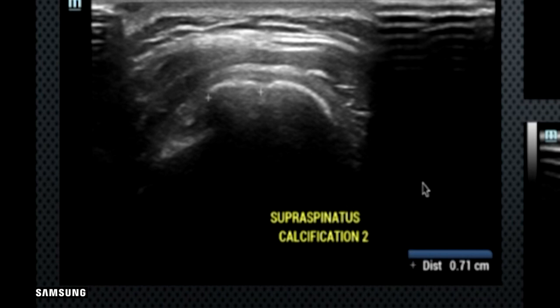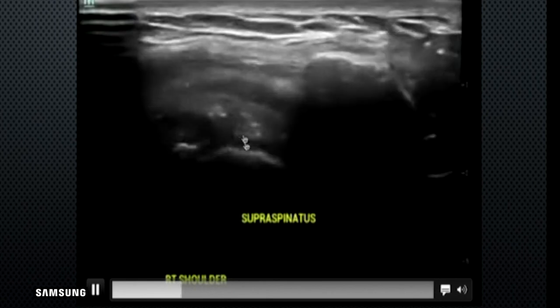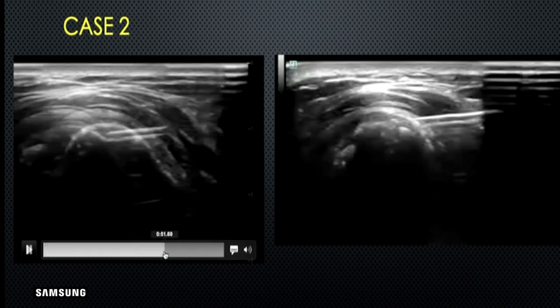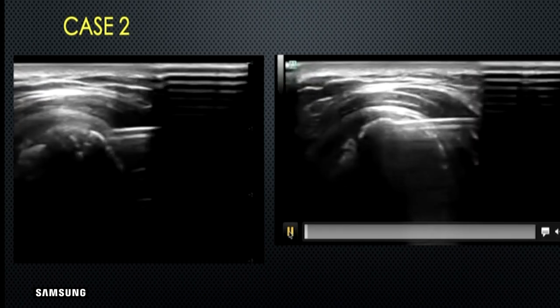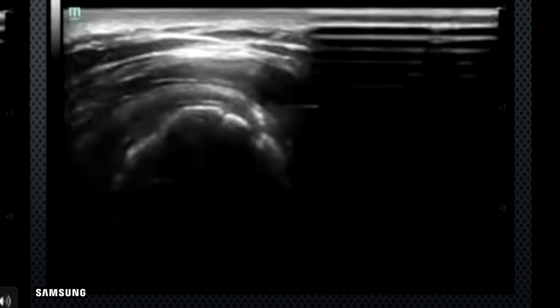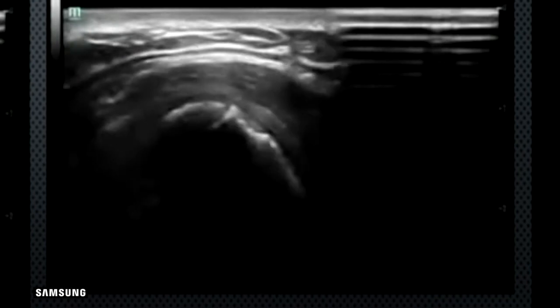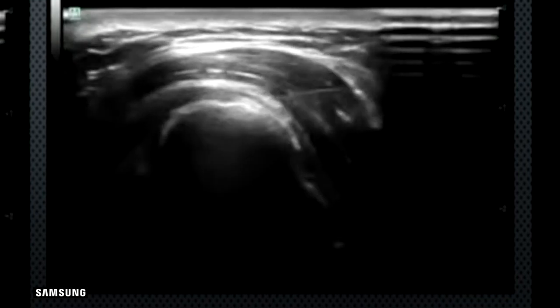These are the hard, tough calcifications which are difficult to maneuver and require a lot of patience. First inject a good amount of local anesthesia around these calcifications — this is the impingement happening underneath the acromion. With an 18-gauge needle, poke the rock-hard calcification firmly. Since local anesthesia has been given, the patient won't feel pain. The outer shell is very hard, but inside it's a fibrous paste, gelatin-like material.